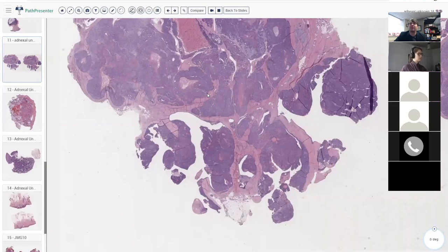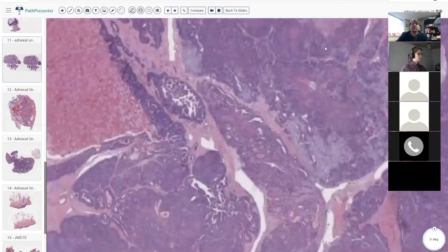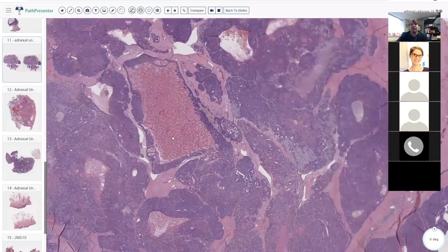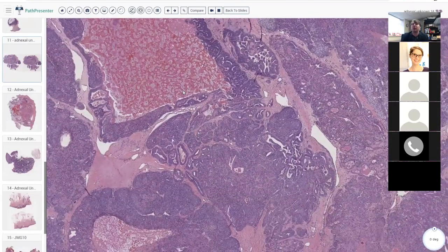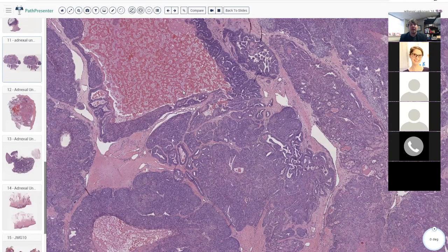Someone mentioned hidradenomaapapilliferum — that would be a consideration in the anogenital area. But the key thing no one mentioned is that we are actually in the finger of a middle-aged man. This changes everything. Yes, very good — this is digital papillary adenocarcinoma, formerly known as aggressive digital papillary adenocarcinoma, although the "aggressive" part got dropped a few years back.